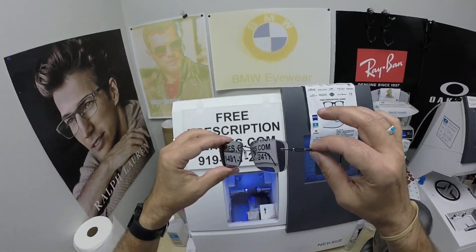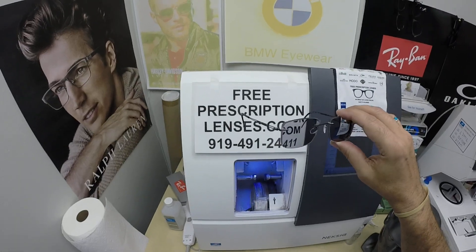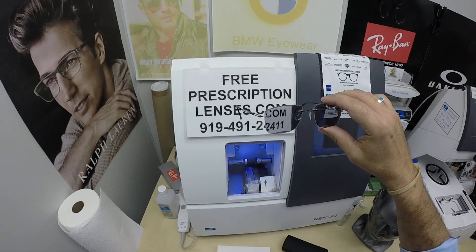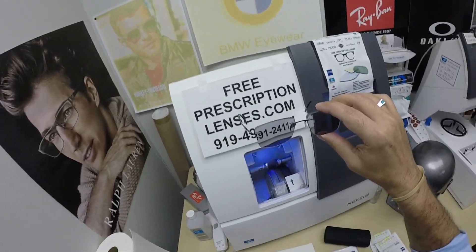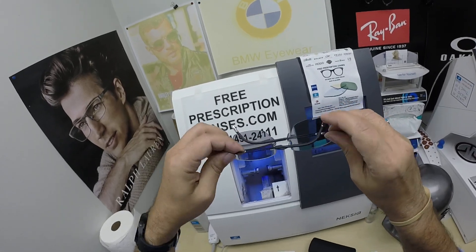This is the lightest weight pair of glasses out there. Lee has said this is about his third or fourth pair — they will spoil you. It's like wearing bedroom slippers when every other pair of glasses is army boots. It's hard to switch. There's nothing lighter weight or more comfortable.